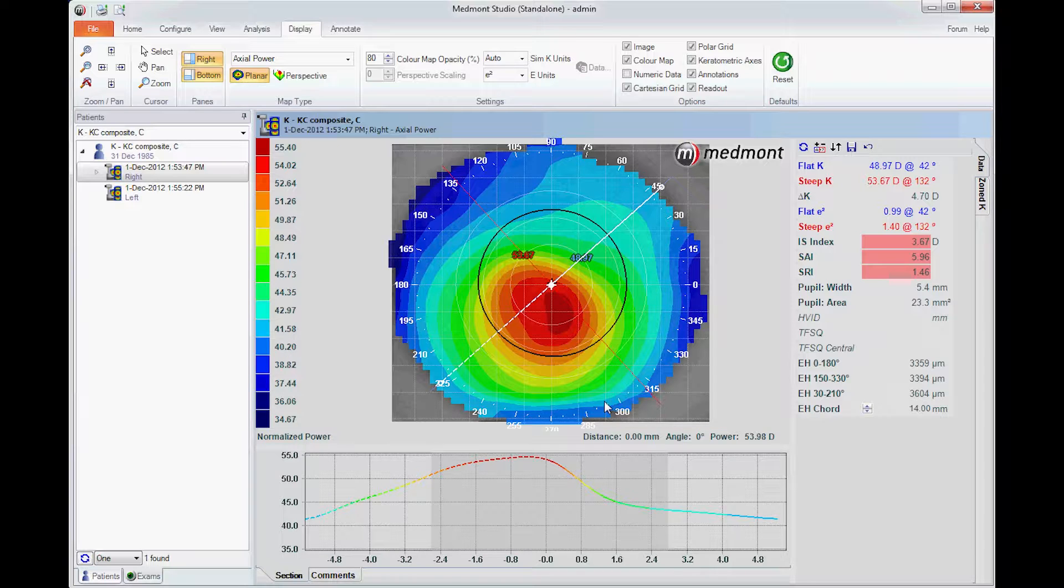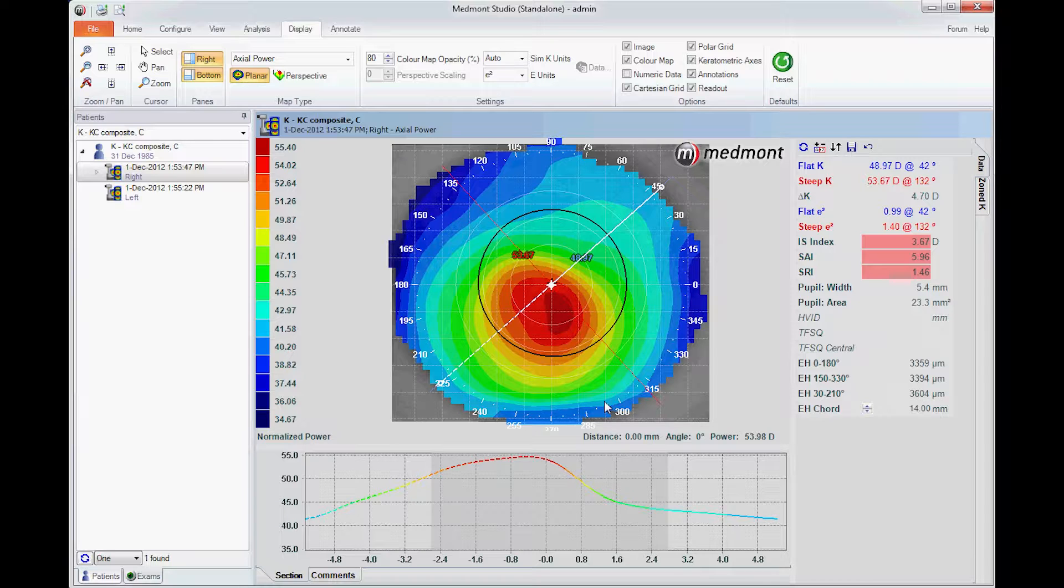This means that the Medmont Corneal Topographer can be beneficial in calculating or estimating the sagittal depth for your initial scleral or custom soft lens.